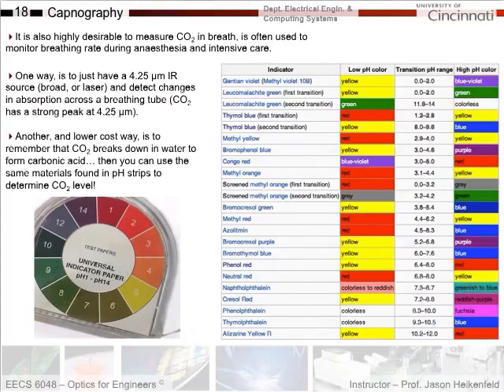Okay, just two more quick subjects and you are done with the video lectures for this course. So, it's also highly desirable to measure carbon dioxide in breath. If you're looking at someone in intensive care, you want to make sure they're oxygenating themselves and breathing appropriately. Also during anesthesia, when you're under deep anesthesia.